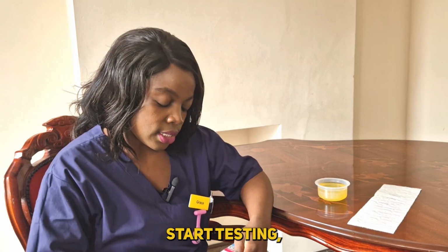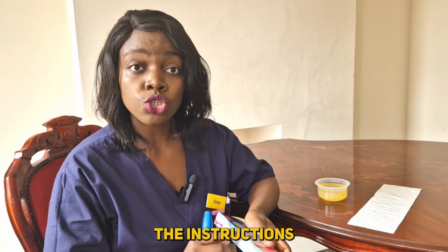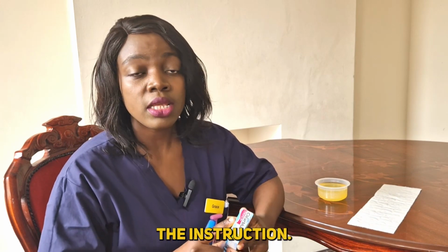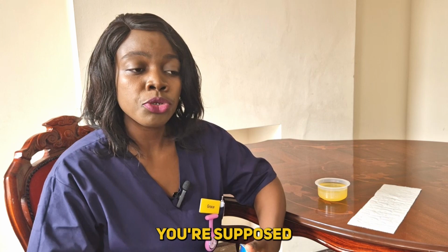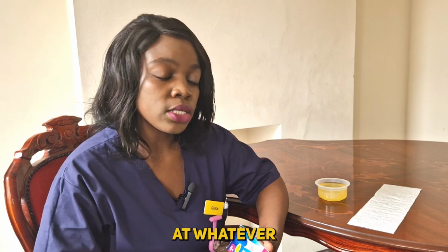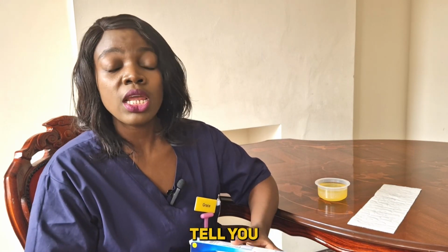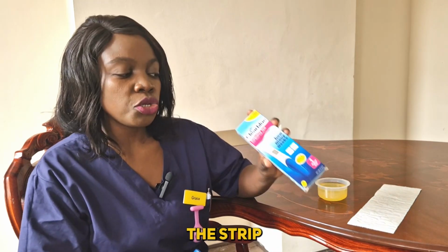And before you actually start testing, it usually depends on the package. There are those packages that come with the instructions on top of the box, on top of the paper, and there are those packets that come with the instruction inside. There's a leaflet inside. For this one, I don't have the leaflet, but it came with a leaflet inside. It's better for you to read the instruction, know how many minutes you're supposed to leave it settled before you look at whatever the result is. Let it tell you how many minutes you're supposed to be dipping inside the urine before you put it in the tissue or whatever. Read the instruction very well. It will tell you exactly how to do it depending on the strip that you have.